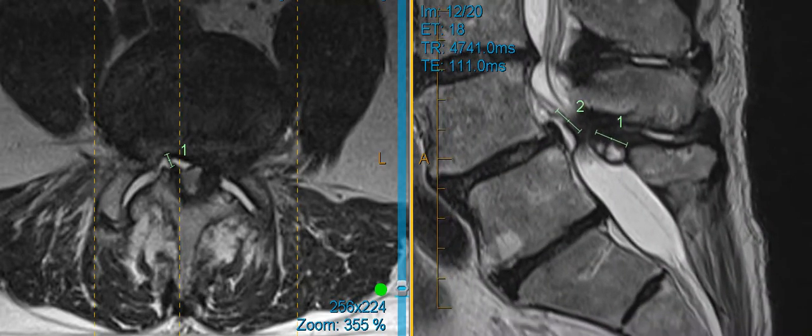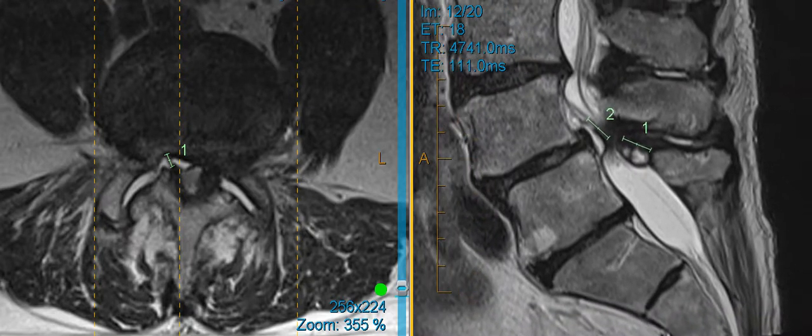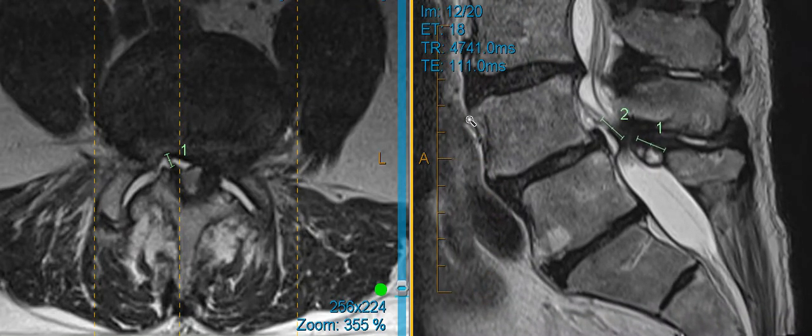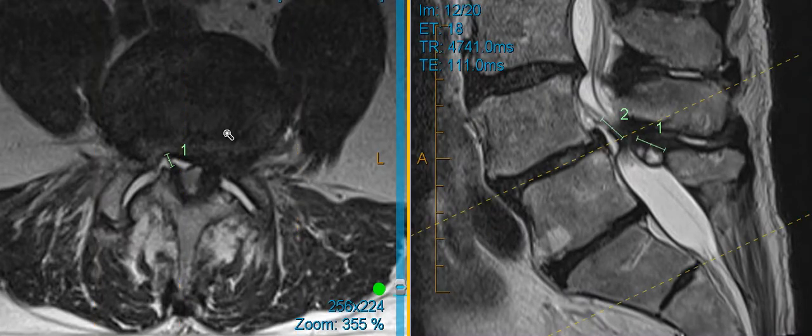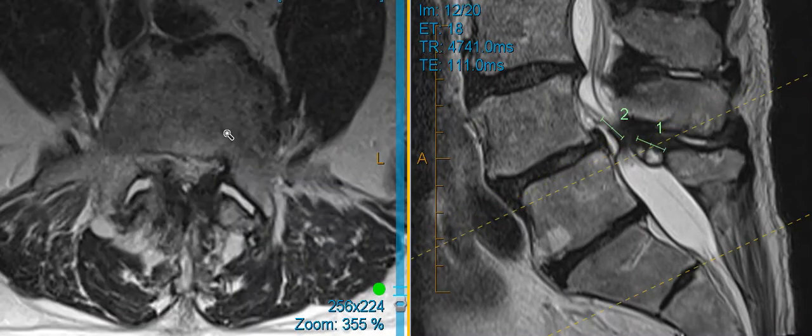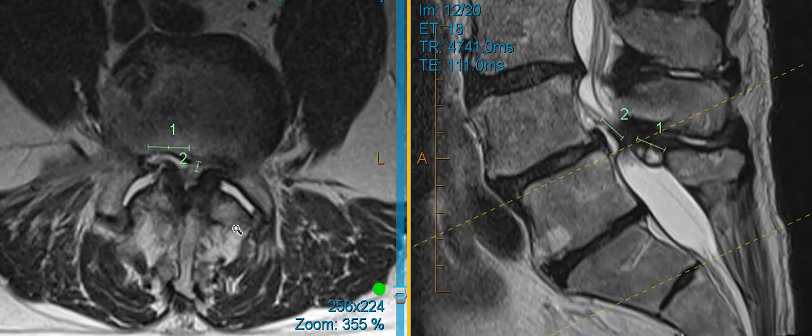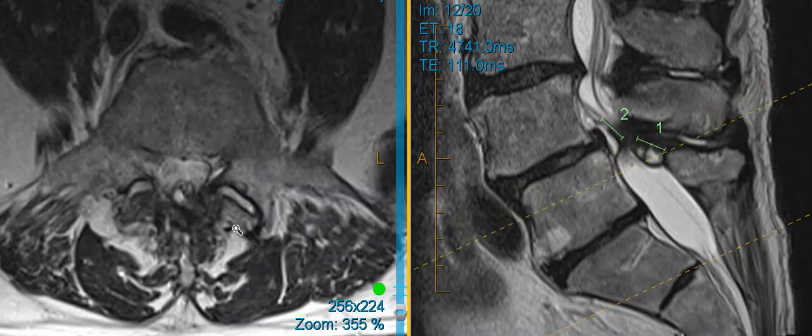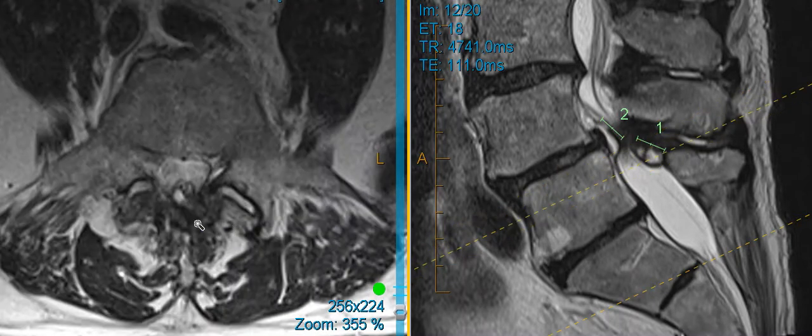When I see a synovial cyst, we see that typically show up when a patient is having some instability or micro instability, meaning the bone is actually slipping. The cyst arises from the joint in the back of the spine called the facet. You can see these facets have a bunch of fluid in them. That's another signal that there's some slippage going on.